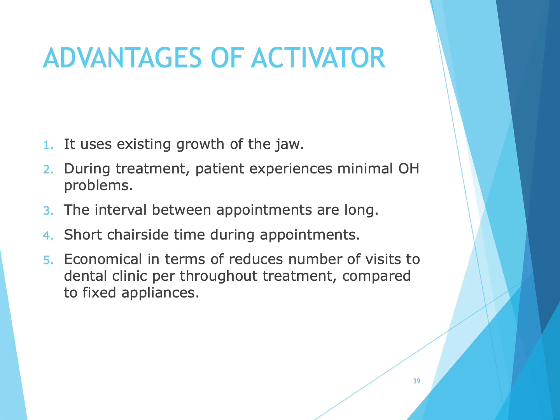Now, what are the advantages of the activator? It can be used to exploit existing growth of the jaw, and during treatment, the patient experiences minimal oral hygiene problems. The interval between appointments is long, and there is also a short chair side time during appointments, and it's also very economical in terms of reduced number of visits to the dental clinic per thorough treatment compared to fixed appliances.